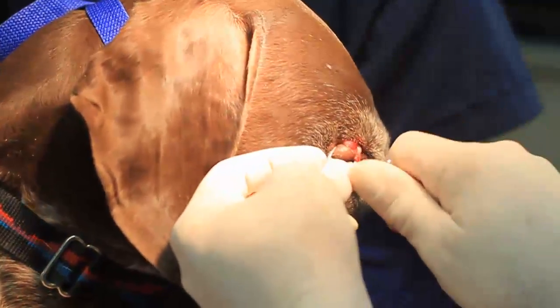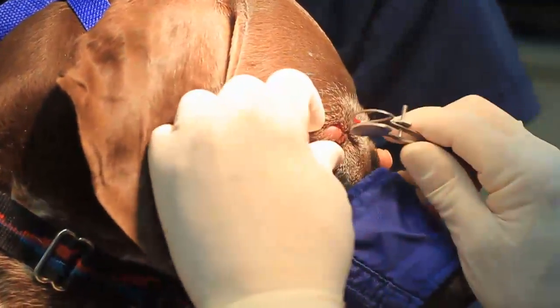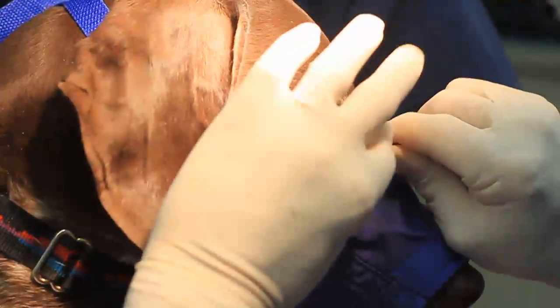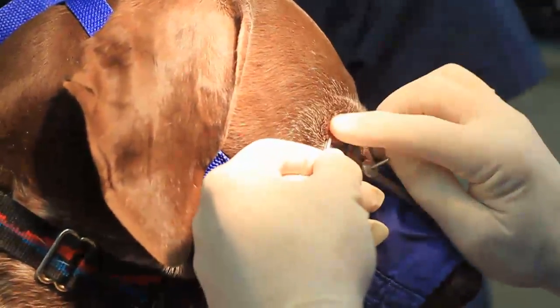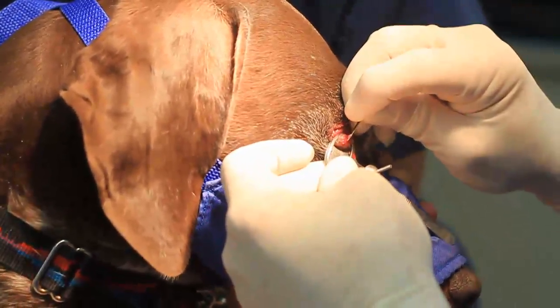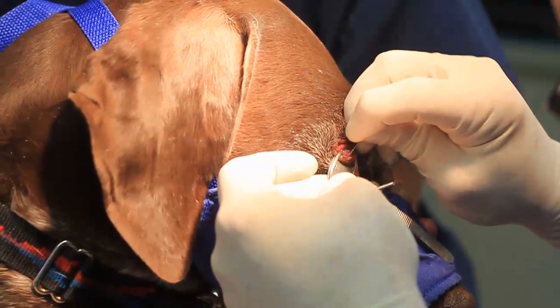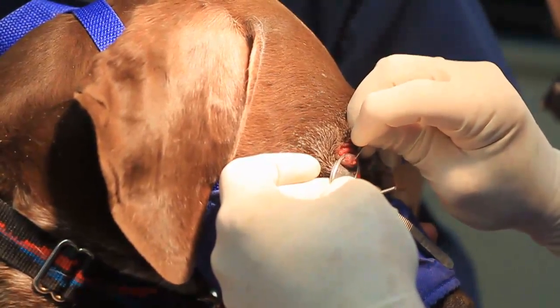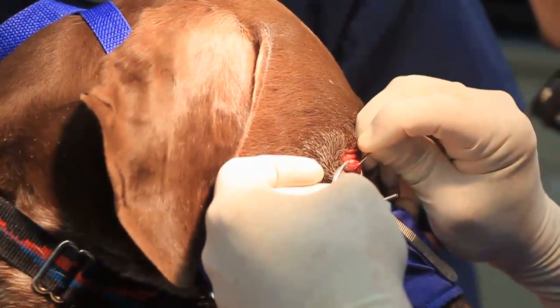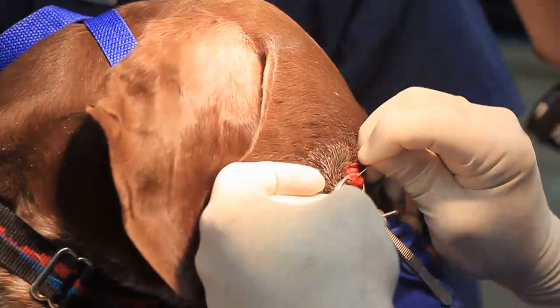You literally scrape that down until you get down to shiny tissue coming out of the meibomian gland area. I'm going to reposition this chalazion forcep so that we have a little bit less of that tissue blebbed up — it will make it just a little easier to see what we're doing. Now we're just going to carve this right out of here, right down to shiny. The shiny tissue gives you the level that you have to carve down to.